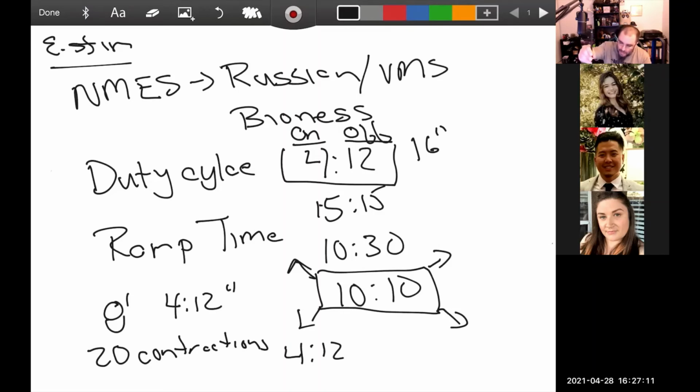If you are doing the E-stim and you're there with them that whole time they're having E-stim, that is considered attended E-stim. If you set up the E-stim, give them a timer, give them a bell, and walk out of the room, that's unattended E-stim. We'll talk a little bit about that. The main difference is you can bill multiple units of attended E-stim, but you can only bill 1 unit of unattended, just because they say, we're only going to reimburse you for doing one thing not with them, kind of idea.